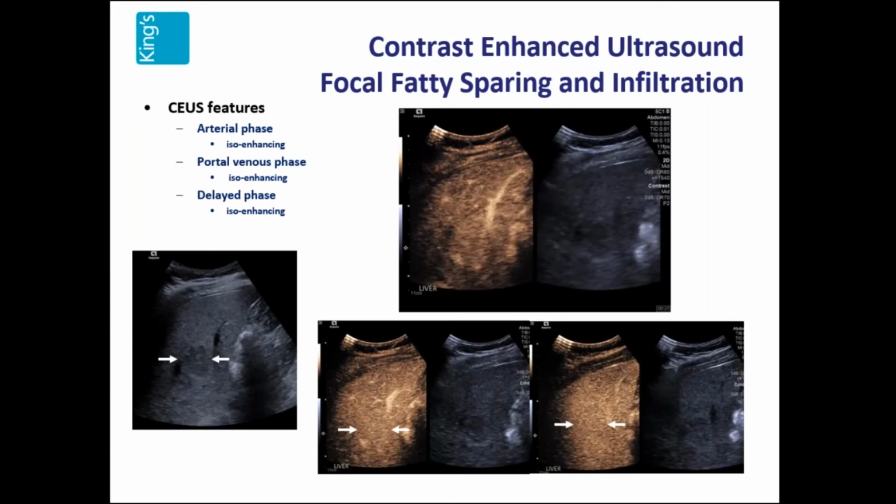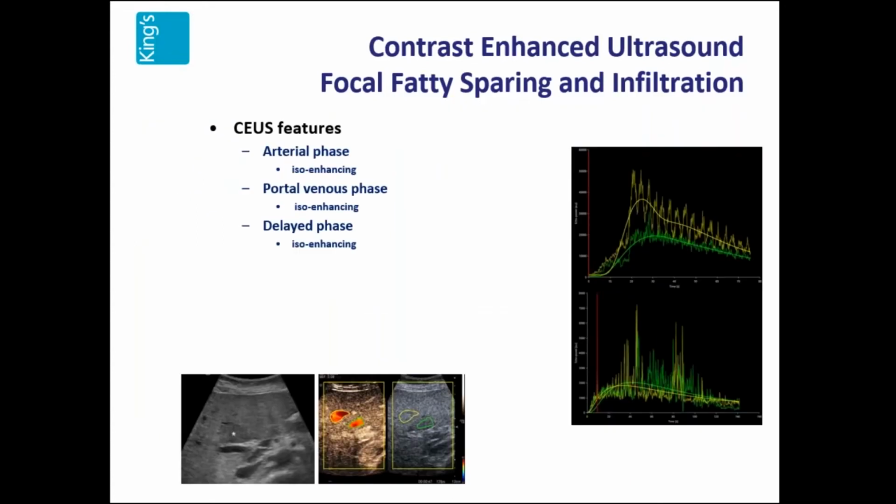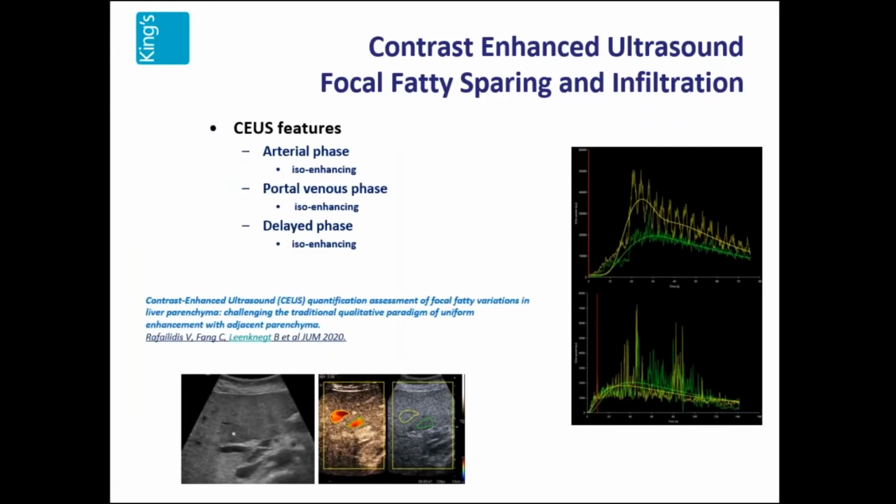However, as we've seen more and more of these cases, and in keeping with our clinical perception, we felt that some of these areas of focal fatty sparing actually take a little bit longer to enhance. And we've got a publication coming through shortly to show you that there is some slower enhancement in focal fatty sparing, but not in focal fatty infiltration. And we're not sure why.